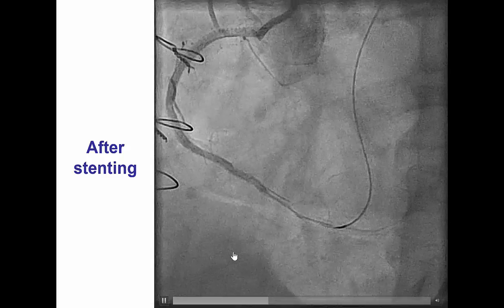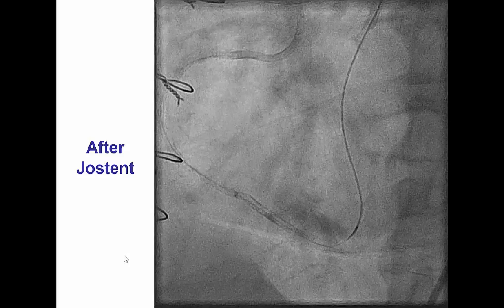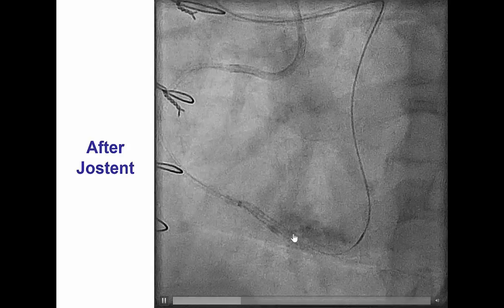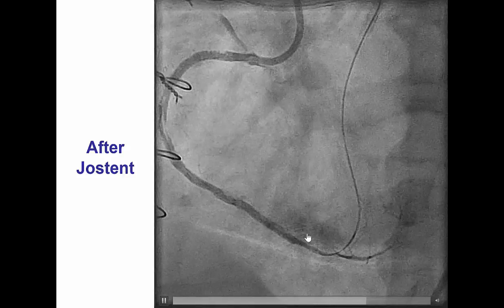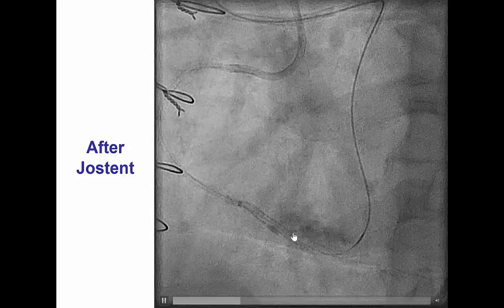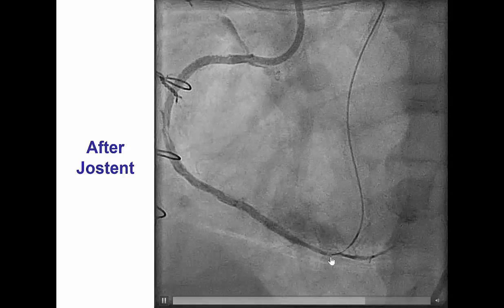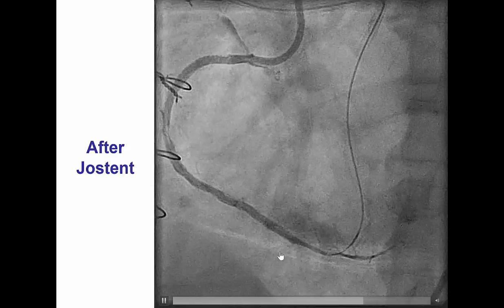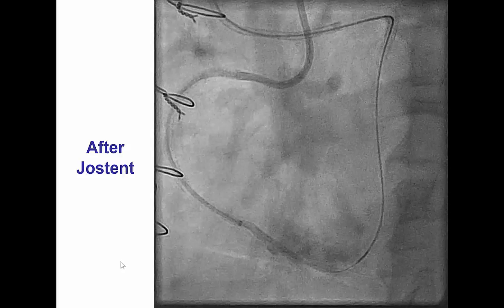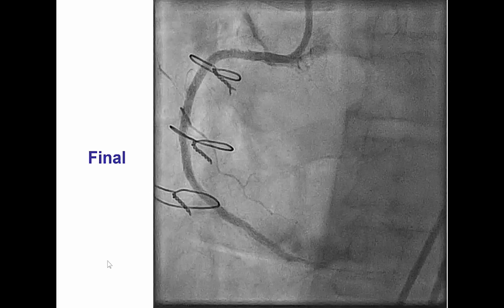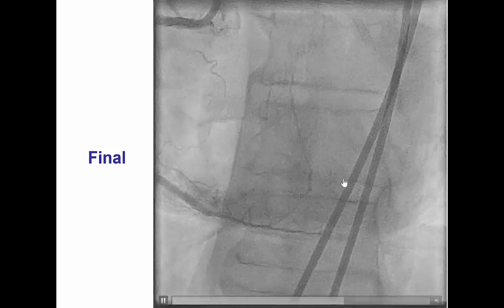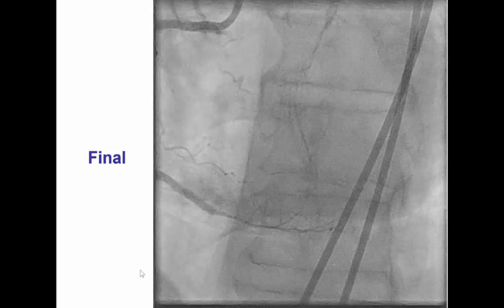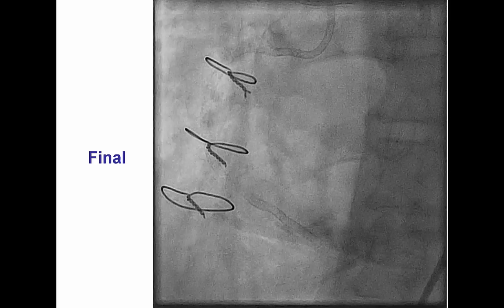That is why we want to treat these perforations very promptly. What we did is deploy a JOSTENT covered stent into the origin of the collateral vessel. Sometimes one can go into the perforated branch and put in a coil or fat, however this vessel was very small and hard to wire. The alternative solution is to advance a covered stent and cover the origin of the perforated branch, minimizing bleeding into the pericardium. The patient had a nice final result with TIMI 3 flow into the PDA, only minimal effusion on echocardiogram, and did not require pericardiocentesis.